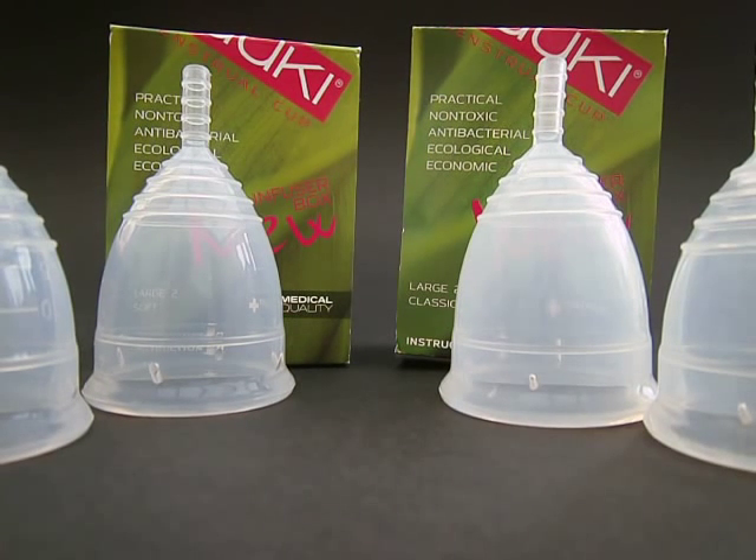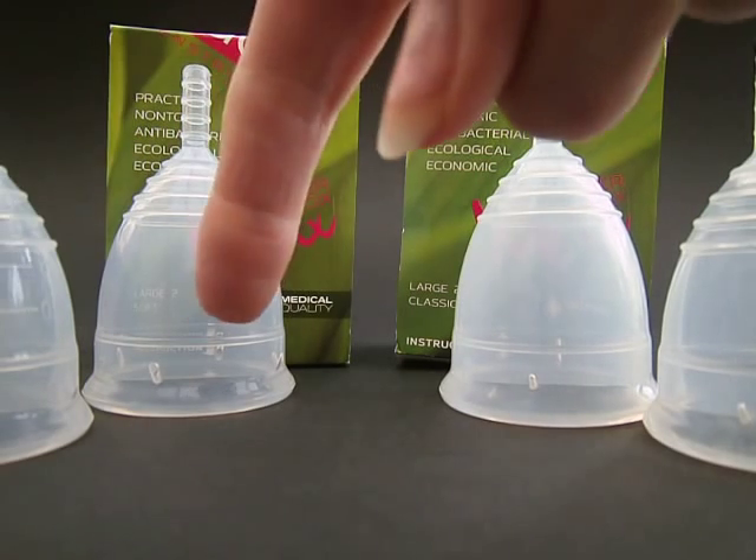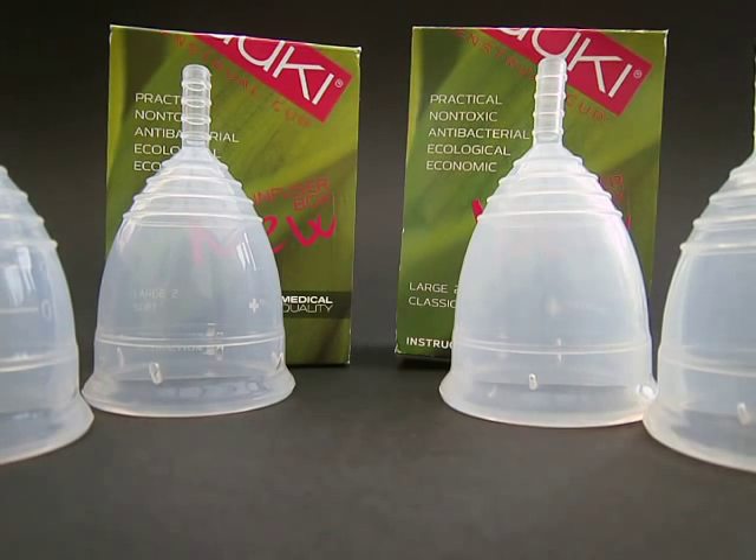These are the Yuki menstrual cups from the Czech Republic. They're now available in soft or classic, small and large. So you can choose your own size and choose the thickness that you'd prefer of the material.